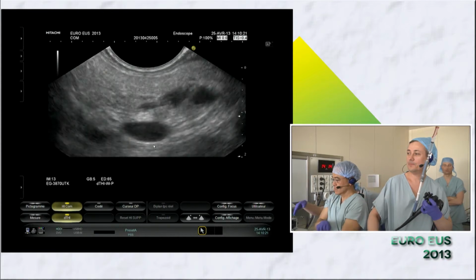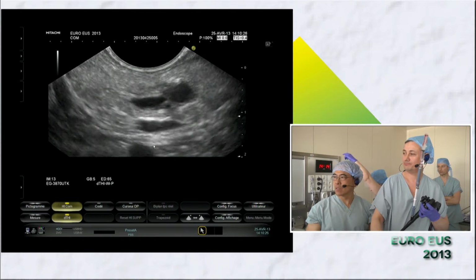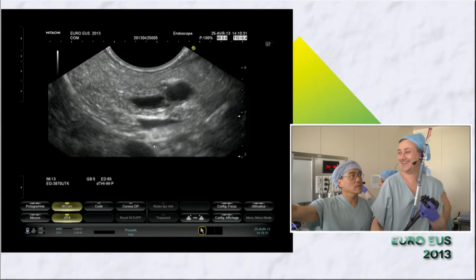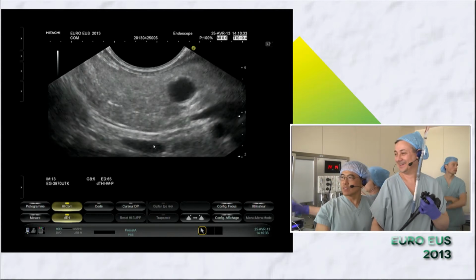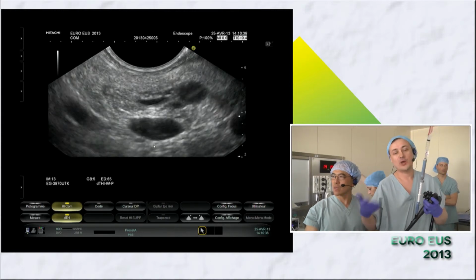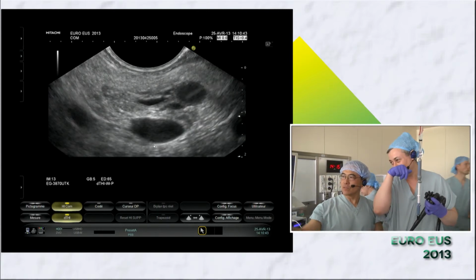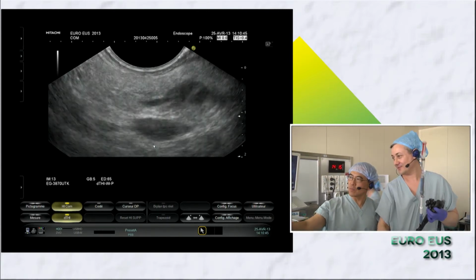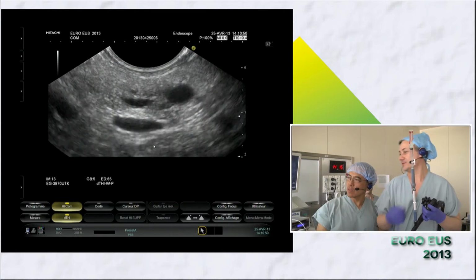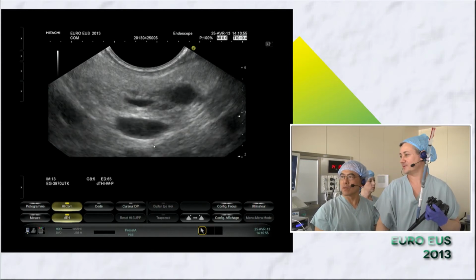Now the needle is inside, and you can aspirate a little bit of fluid, it will be okay. Yeah, it's really small, and that's the splenic artery nearby. You still see that? For me it's enough. We can do it with an FNA, so it's not a problem. But the question is, should we do FNA? Do we still need that? Actually, I think it decreased a bit in size. Probably we aspirated a bit when we withdrew the needle. So now it's really small.